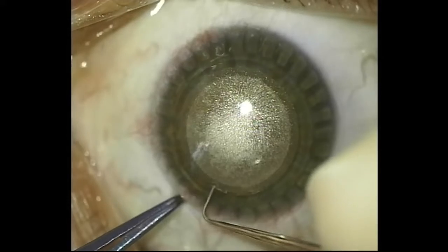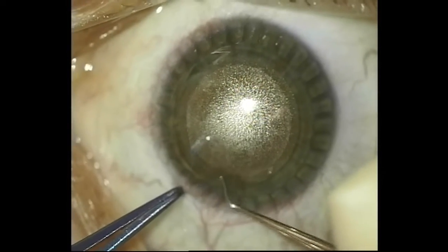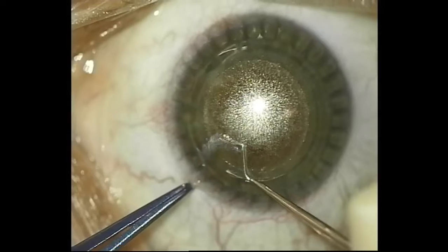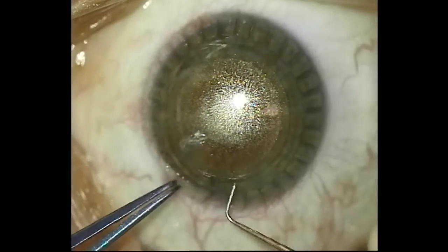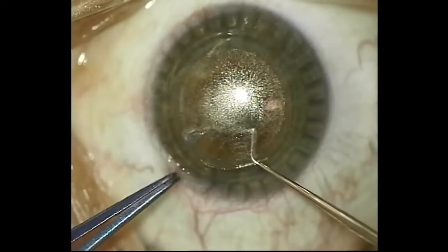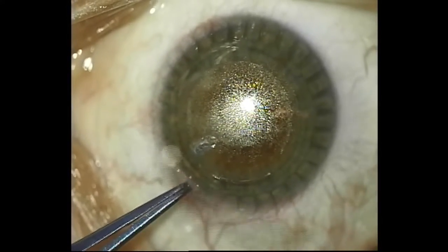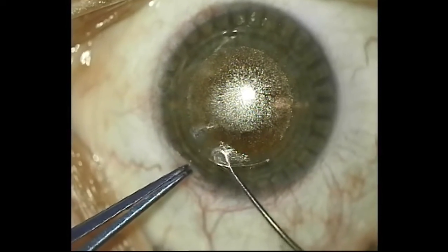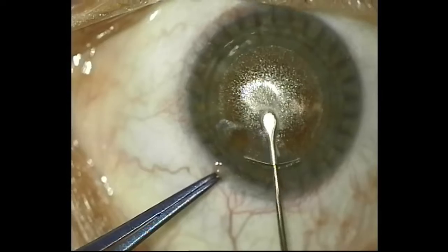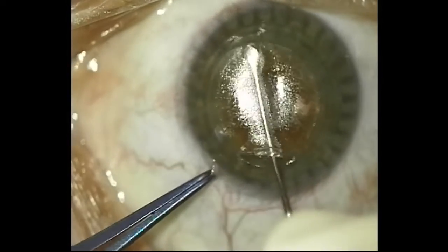Here I am under the scope of the Visumax, making my opening into the tunnel to access the lenticule. I'm aiming up anteriorly, pushing almost against the anterior cap to make sure I'm in the anterior plane. You see how there's no bubbles above my instrument. Now I'm going to the other side of the wound and aiming posteriorly with almost downward pressure — and you can see there are bubbles above my instrument now. It's a little more resistant in the posterior plane, and that's how I know I'm below the lenticule. With my dissector, I aim back up into that anterior space — no gas bubbles above my instrument, which means I'm in the anterior plane. With a windshield wiper type of motion, I slowly dissect the anterior plane. There's no reason to rush.